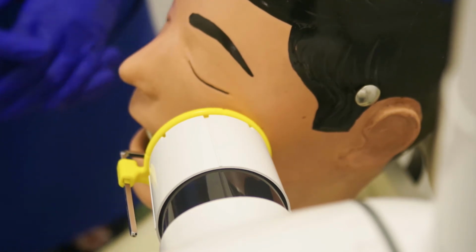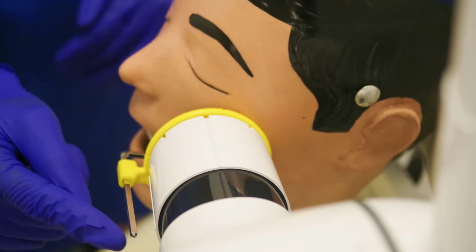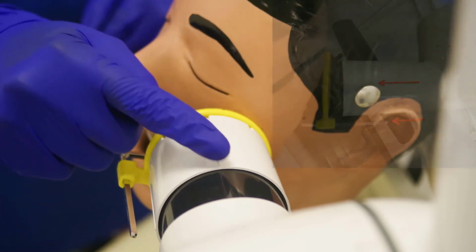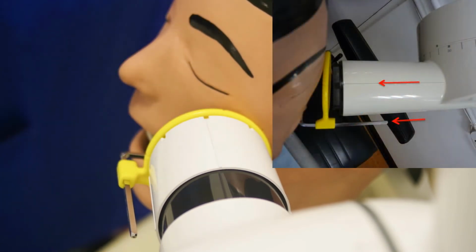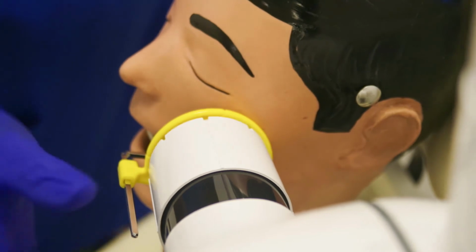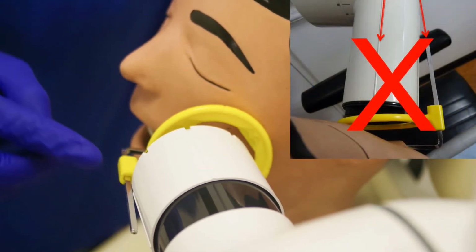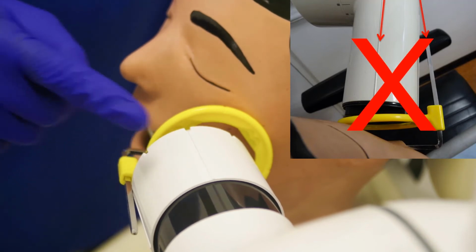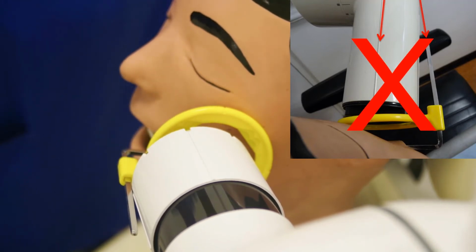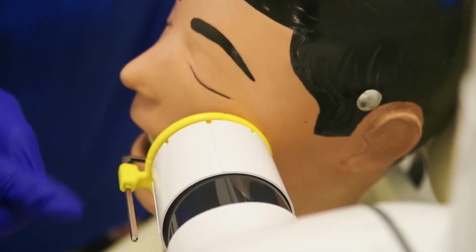Okay, so for your horizontal angulation, you want to make sure that this line here is parallel to this metal rod. And as you can see, this is parallel, so it means that your horizontal angulation is adequate. If it's not, as you can see here, it's slightly tilted. If you take the X-ray with this sort of positioning, what you're going to get is a lot of overlapping of the crowns of the teeth. So you'd want to make sure that it's parallel.